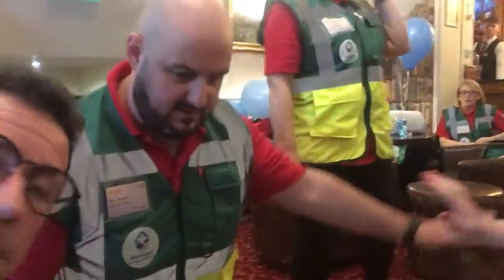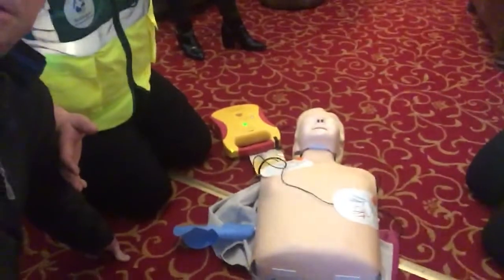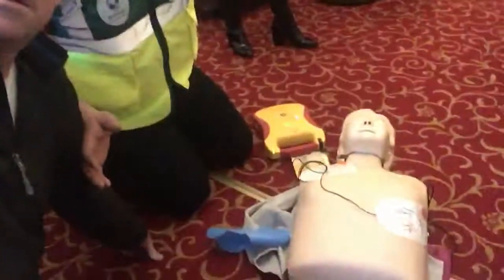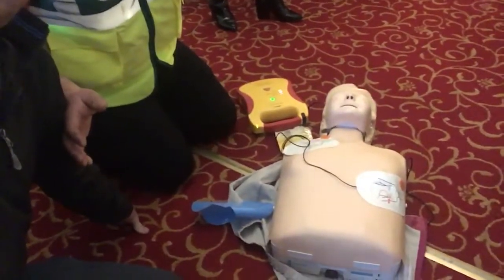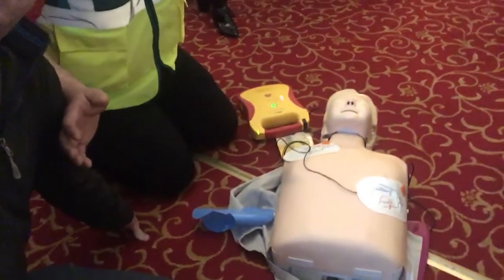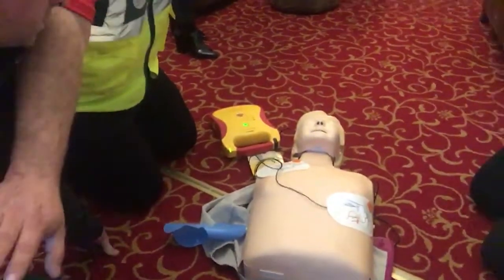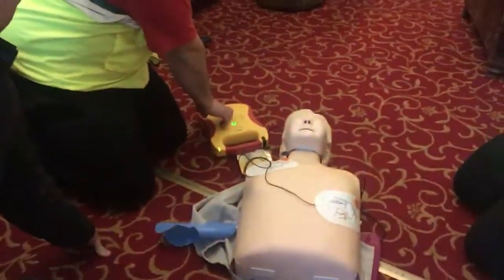Analyzing heart rhythm — stand clear. It's telling us not to touch the patient. Shock on the way — it's checking the heart. Shock advised — charging, stand clear. It's telling us to give a shock, so we need to make sure everybody is standing clear. Press the flashing shock button — everybody back!